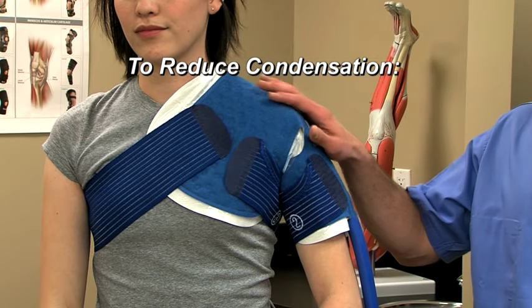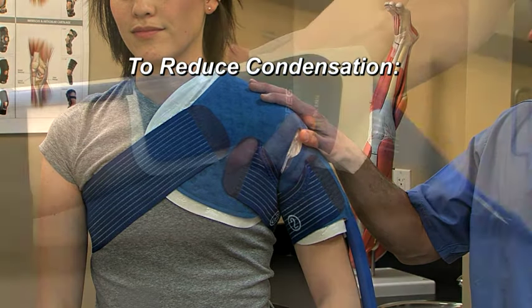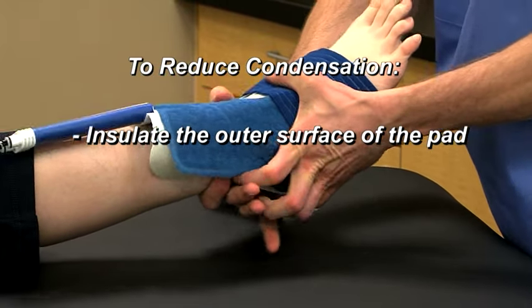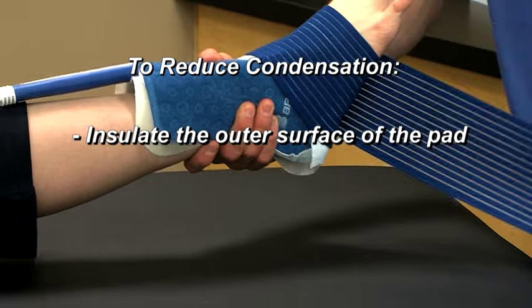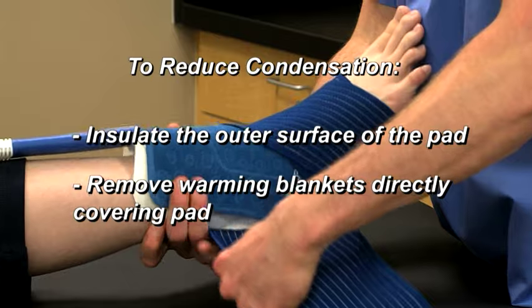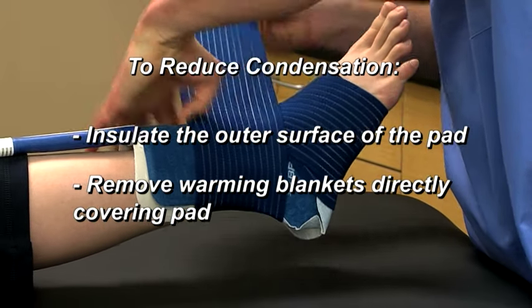If excess condensation appears on the surface of the pad, wrap the outer surface with an ACE bandage or similar material to prevent warm, humid air from coming into contact with the pad. Also, remove any warming blanket that traps warm, humid air above the surface of the pad.